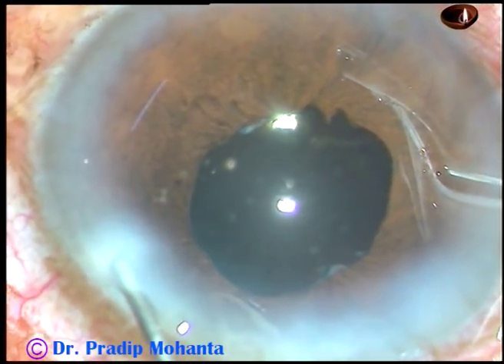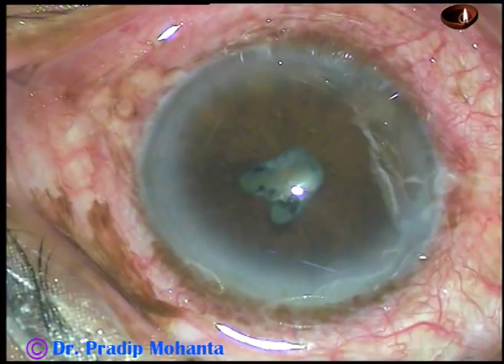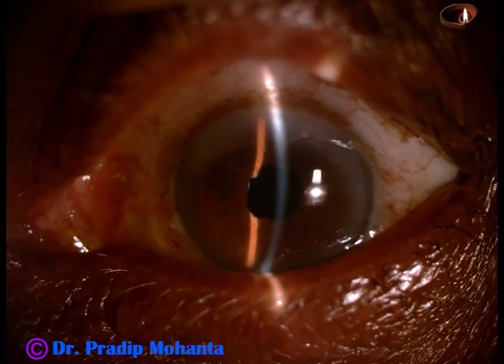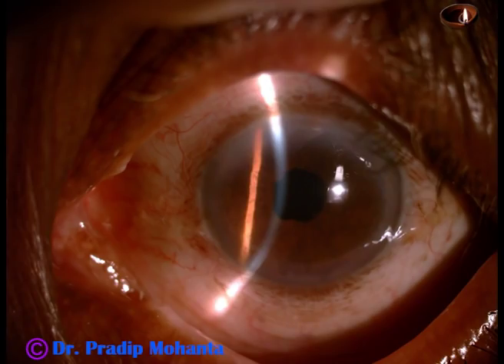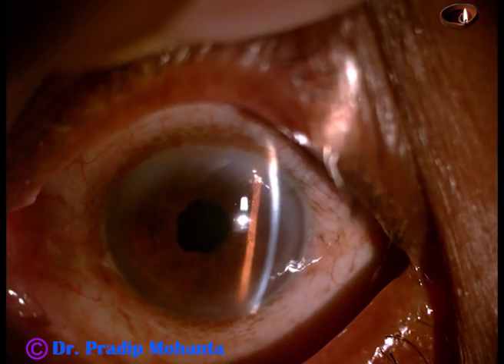A bit of moxifloxacin is injected. Now the side ports are hydrated, the anterior chamber is formed, and the case is concluded. We started our journey from here and we have reached to this point — it has been a very satisfactory journey. I have taken some post-operative pictures after 20 hours. Cornea is clear, anterior chamber is quiet, IOP by non-contact tonometer is 12 mmHg, and wounds are nicely apposed. It has been a very satisfactory post-operative result.